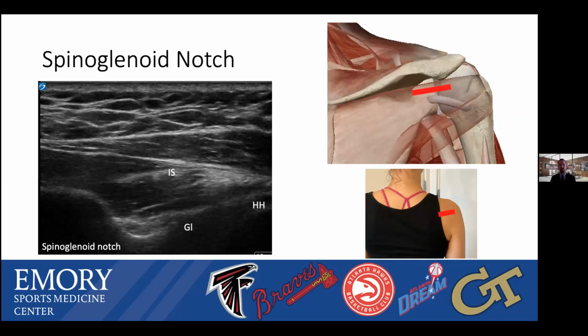There's a normal venous structure within this area, so you don't want to miscall that venous structure for a cyst. And you could distinguish the two by doing internal and external rotation. And with external rotation, the venous structure will enlarge and then collapse when you go into internal rotation, where that won't occur with a simple cyst. So that's a good way to tease that out. You could also throw on Doppler to aid in your evaluation as well.